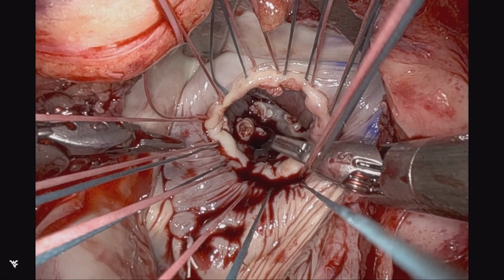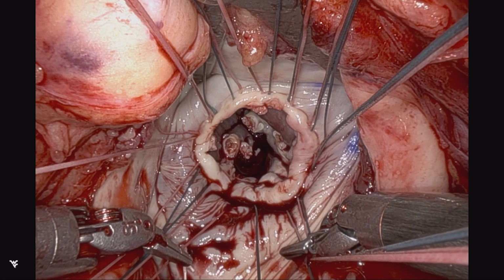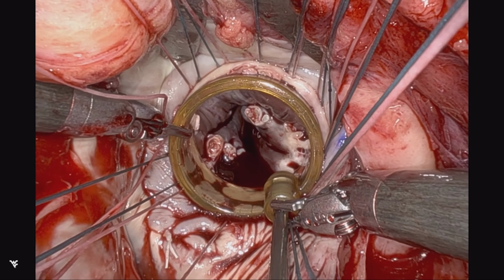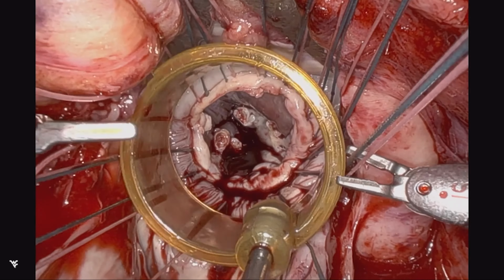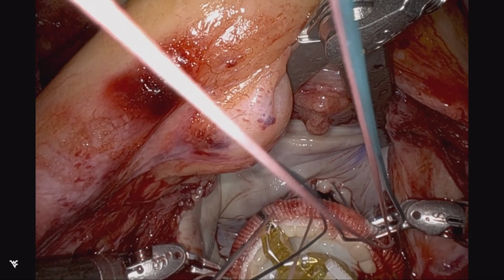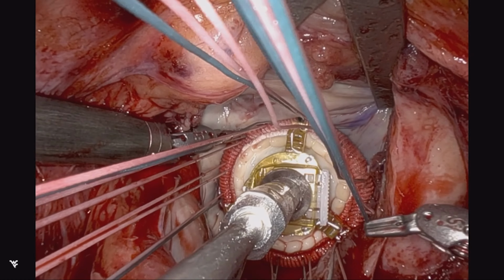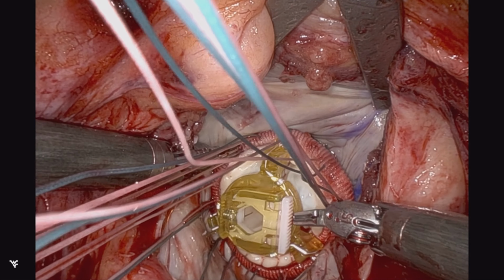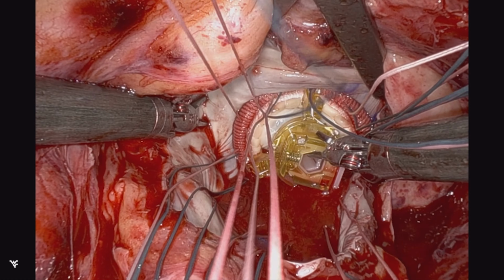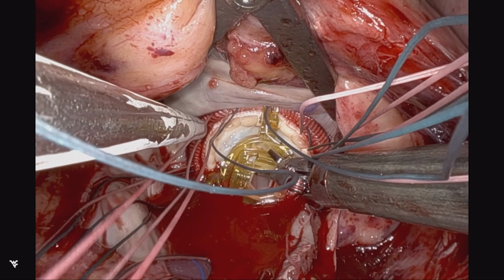The sutures are then placed extracorporeally. We strategize on where the posts will lie. We pass a sizer. In this case, this was a 29 bioprosthesis, I believe. And note that the commissural posts are placed in a very specific way, that I leave the holder on to help facilitate suture placements.